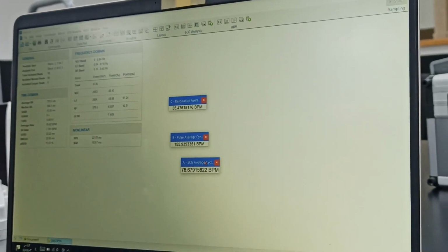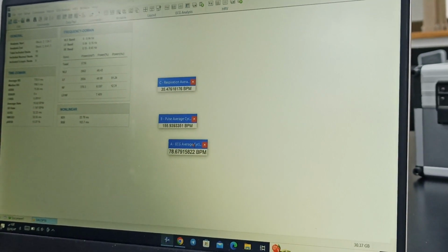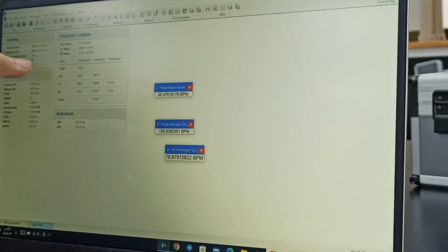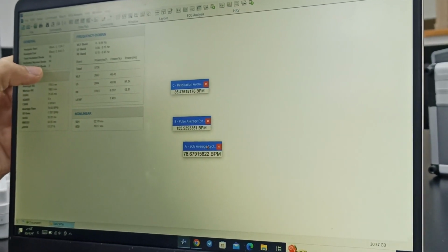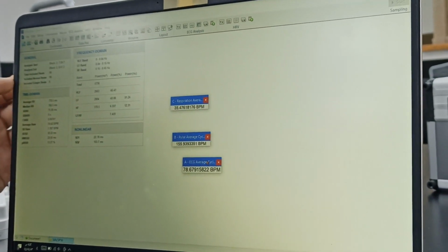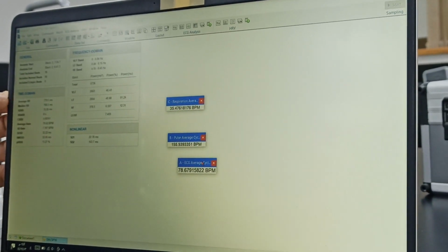If we are having a 5-minute interval, most likely you will have around 300 beats if you have a normal heart rate. Included normal beats 98, included ectopic beats 0. So we have a command there: we would say that we don't want to include ectopic beats, so exclude ectopic beats.